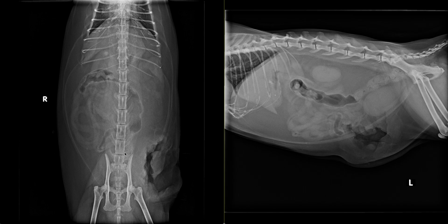There is marked soft tissue swelling and a large defect in the region of the left inguinal area. There is both gas or air opacity with increased soft tissue opacity surrounding this region that is typically occupied by fat opacity. The margins of the skin are markedly irregular, and there is wet hair artifact also observed at this level.